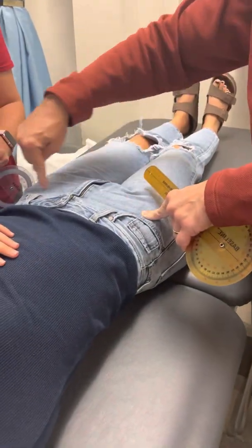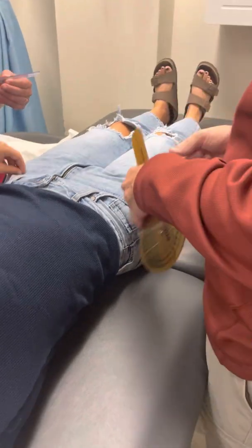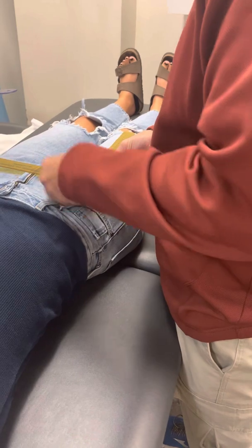The fulcrum is over the ASIS, the stationary arm makes a line between the ASISs, and then you use the midline of the patella, and you're starting at 90 degrees.